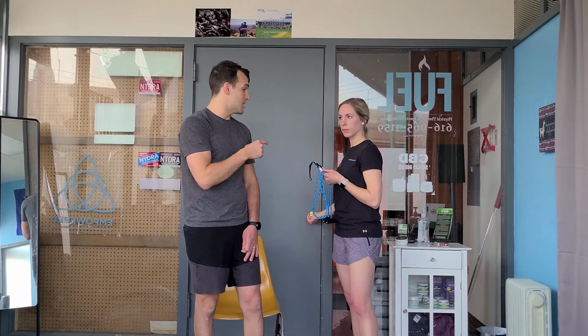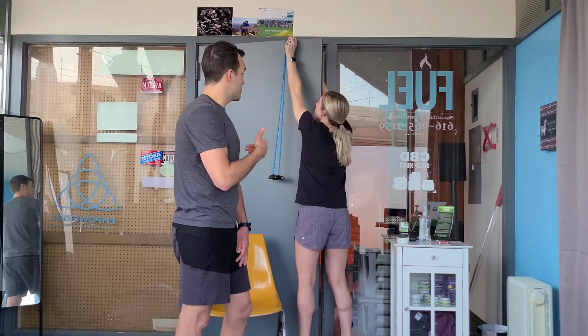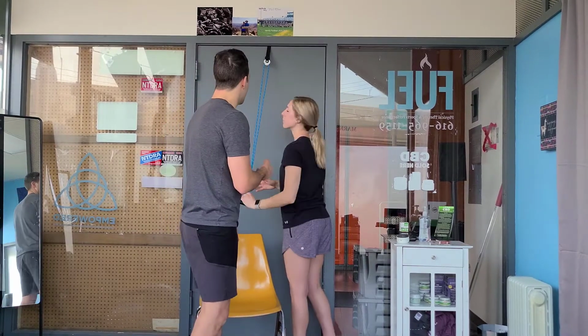And I had shoulder surgery myself. I had a pec tear and repair, so I'm trying to improve the range of motion in my arm, and this is one of the ways that I'm going to be working on my own shoulder for my home exercises. If you have one arm, it can be a little more difficult, so Haley is setting it up for me, but you just set it up over the door and close it, and then it's good to go.